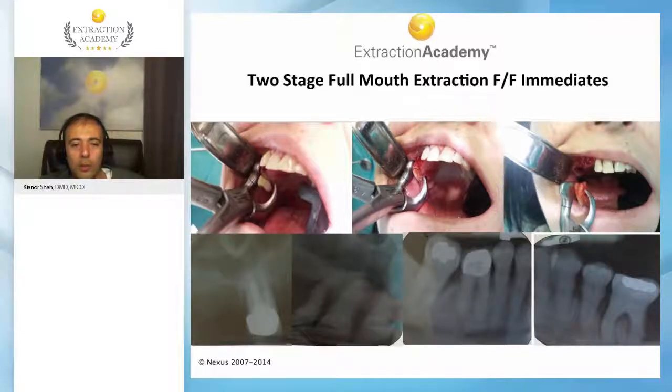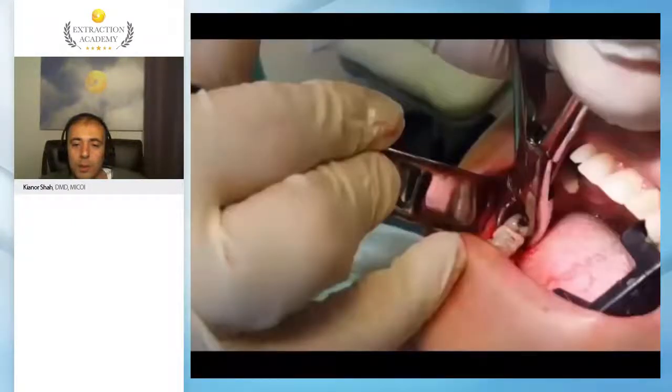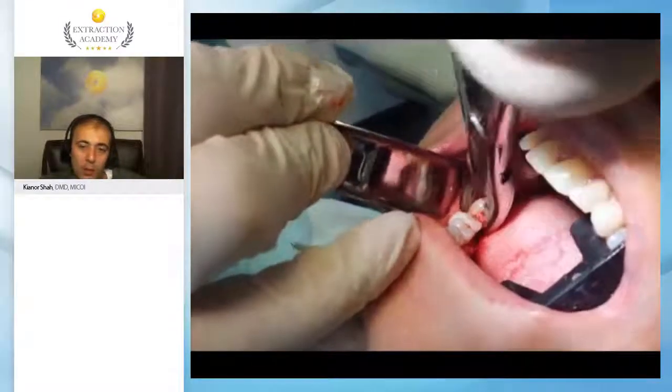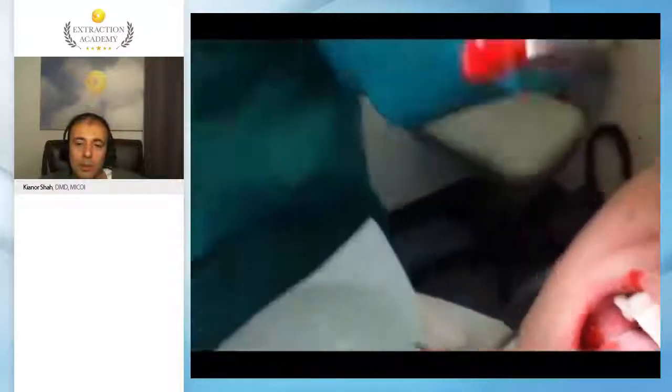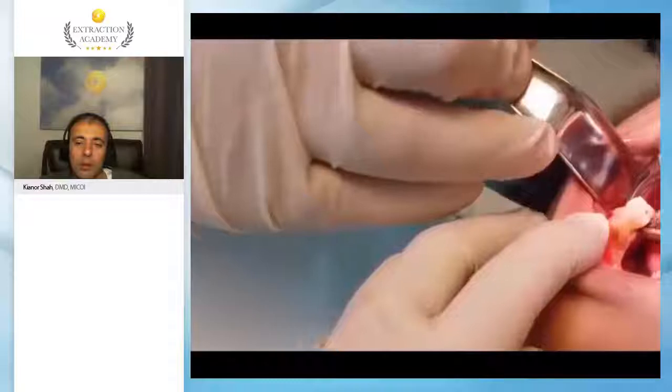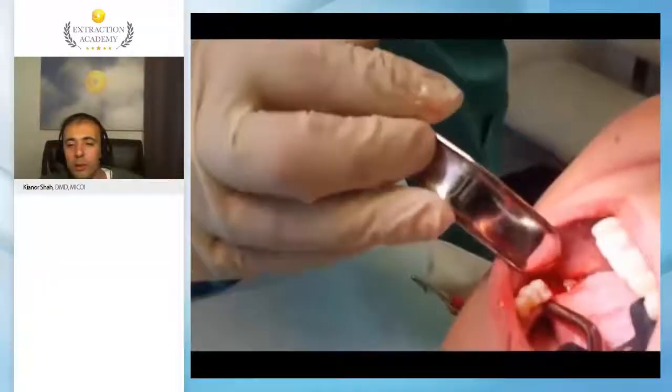And let's go over a few cases of new techniques and technologies that have been deployed to make this extraction procedure simpler. My job is mostly to focus on what happens from the time the patient walks into your door till the time they leave, and within the next few days thereafter, of the decisions that you would have to make. But here we are going to look at a two-stage full mouth extraction, full over full immediate. The patient came to us with the desire to have the posteriors removed, and at a later time an immediate denture placed after we get some healing in the back, and utilize the accuracy of the newer impression thereafter for generation of this immediate denture.